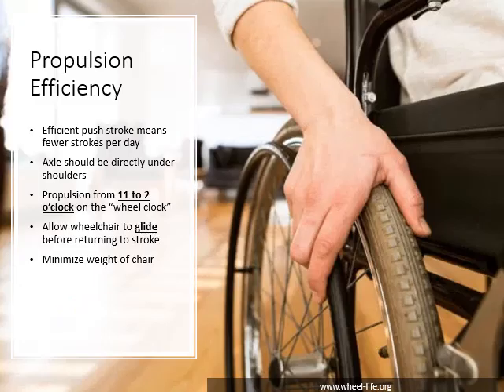We want our clients to be efficient when they use their wheelchairs. Each stroke means each time they push on the wheel. So efficient push strokes will result in fewer strokes per day, so less repetition and hopefully less chance of a repetitive strain injury.